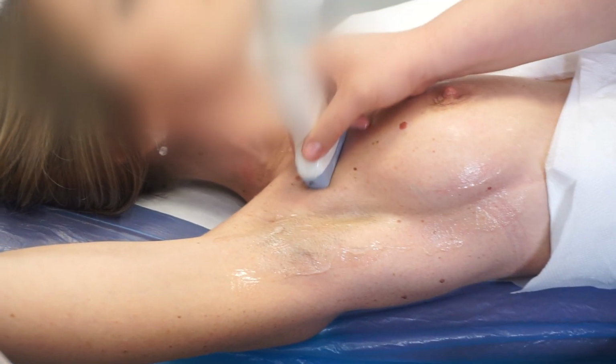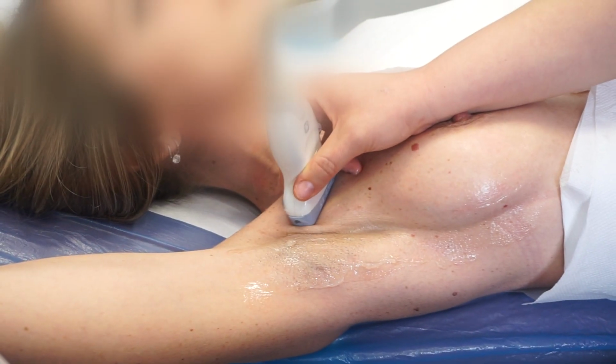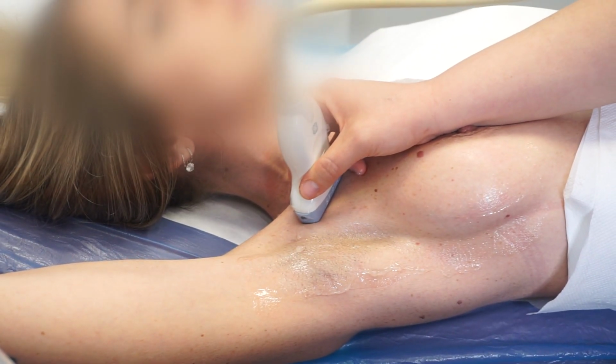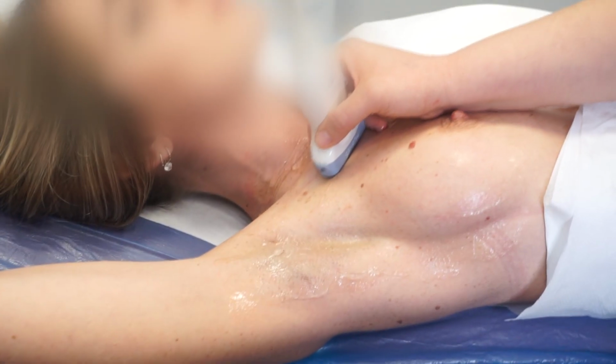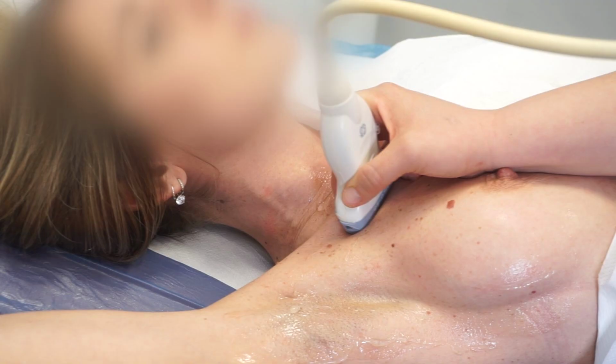The probe is then positioned on the pectoralis major and minor muscles in order to assess the second level of lymph nodes, which are located below the pectoralis minor muscle. The probe is tilted slightly adjacent to the axillary vessels to identify any pathological lymph node. Finally, the third level is assessed with the same method, with the probe medial to the pectoralis minor muscle.